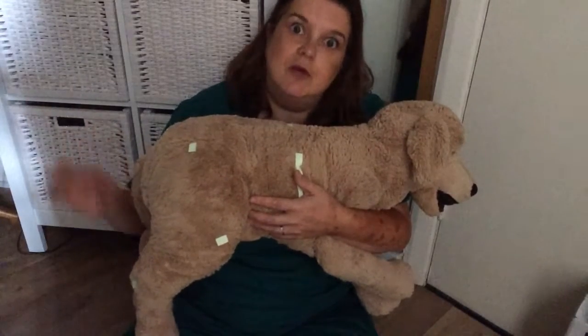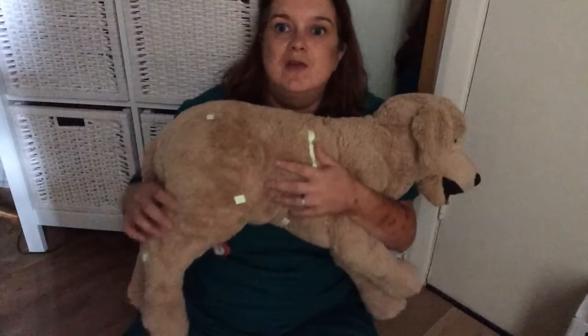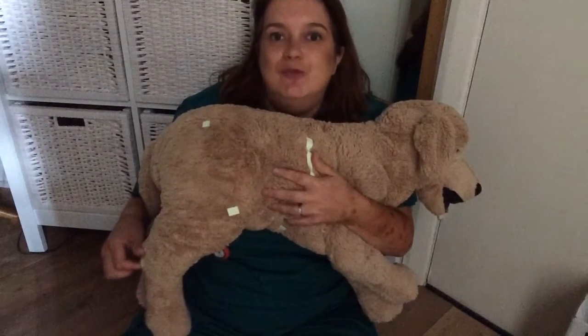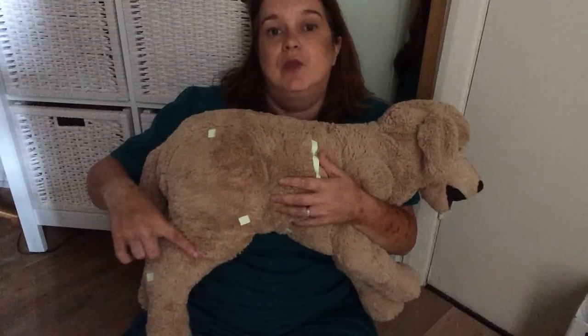So it might seem a little bit bigger than you're actually thinking, but it's an initial survey radiograph for your imaging — we're not looking for a definitive fracture. This is your survey radiograph to say we've pinpointed the problem, then we're going to do further x-rays. Obviously you're only doing one view in the exam, but you would always do two views as minimum in practice. And remember — particularly if you're doing City and Guilds, I think it's the same for CQ — it says to include. So don't go any shorter just because it looks neater; go an inch bigger so you've included. That is hip, stifle, hock: center mid-shaft of the long bone you're taking and include the joints proximal and distal.